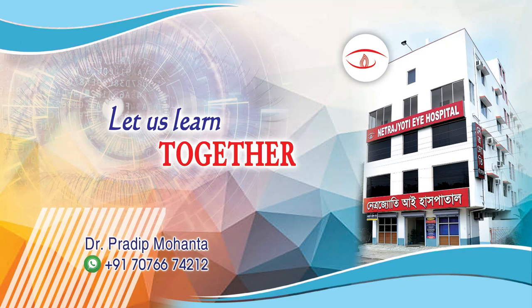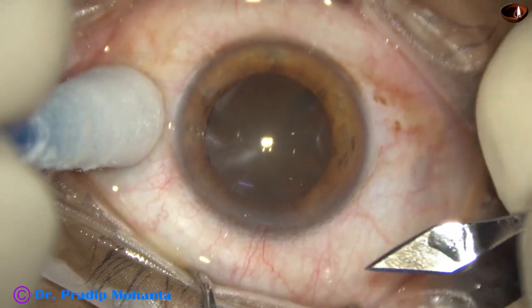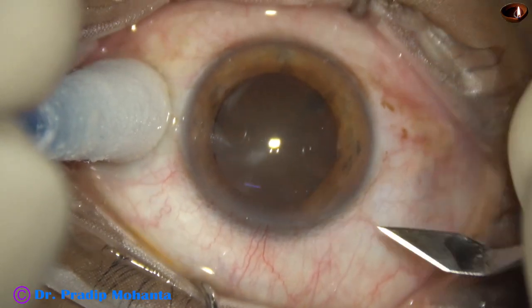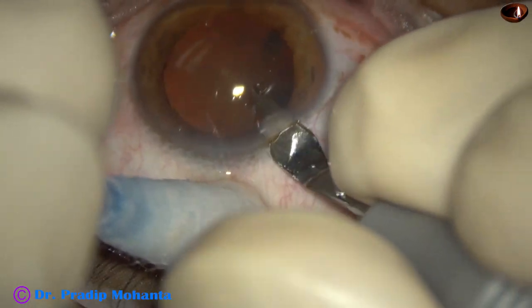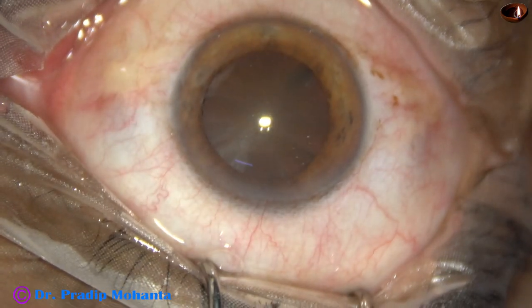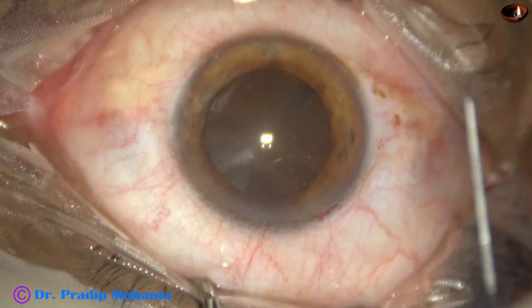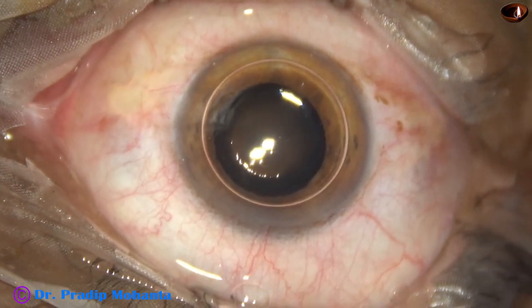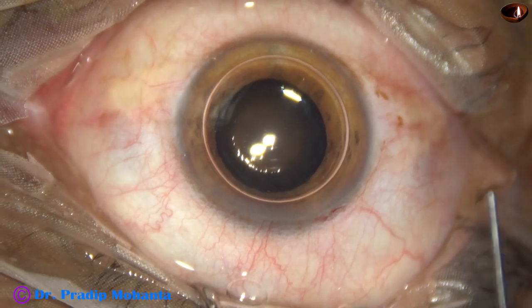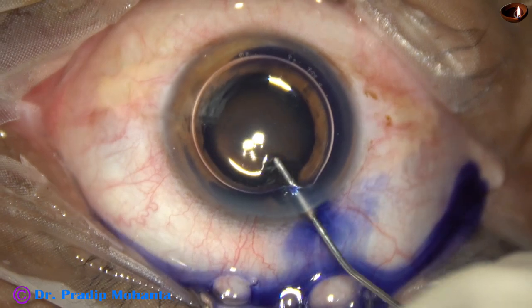In this video, we are going to see management of a diabetic cataract. The patient is suffering from diabetes mellitus for the last 15 years. The cataract appears soft, but it is very much sticky. It is very difficult to hold this kind of cataract and it is very difficult to divide the cataract into fragments. Let us observe this surgery.